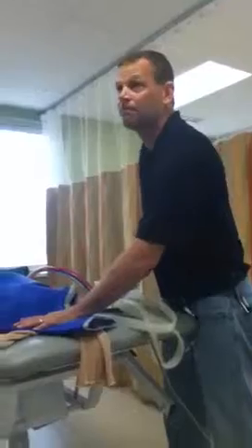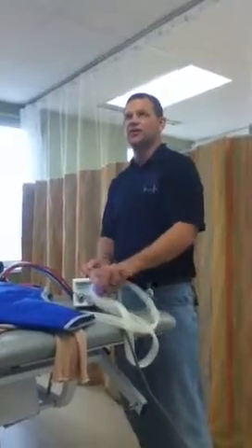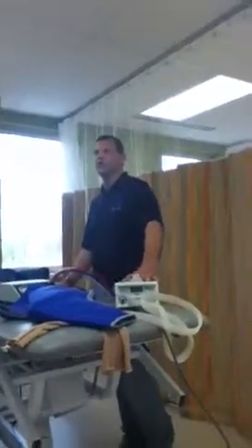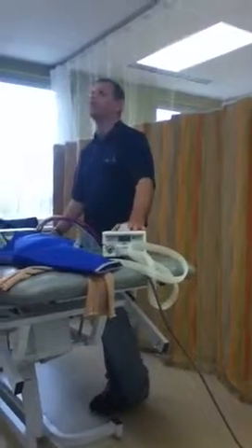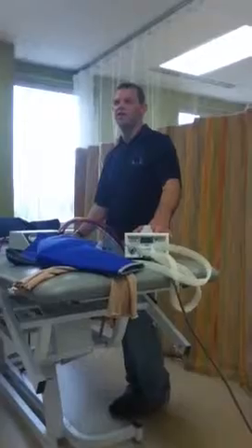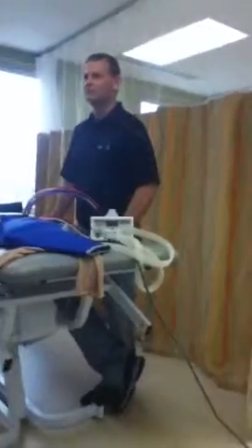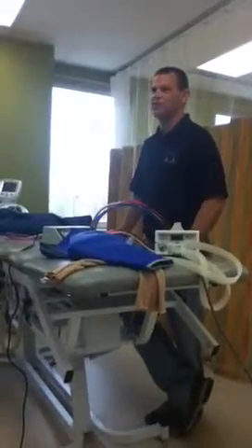That's when you said the person will never exceed systolic pressure. Right — there may be instances where I will exceed diastolic and instances when I won't, but I won't ever exceed systolic. So if I'm going to do this for a practical or for clinic, I'm going to have to take their blood pressure first. Because mine might be 100 and somebody else's might be 180, or my diastolic's 60 and someone else's might be 100. You're not going to want to pump up to 100 just because someone looks older and probably has hypertension. That's venous stasis or venous compression.